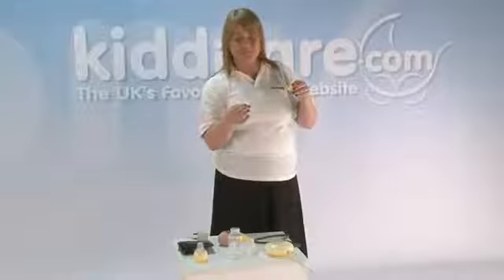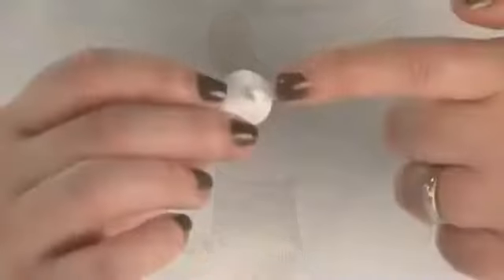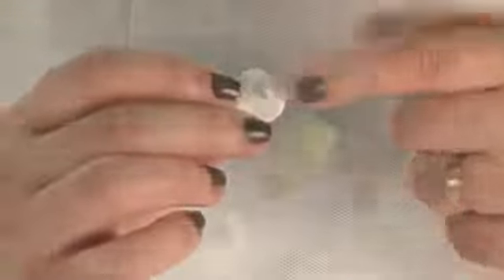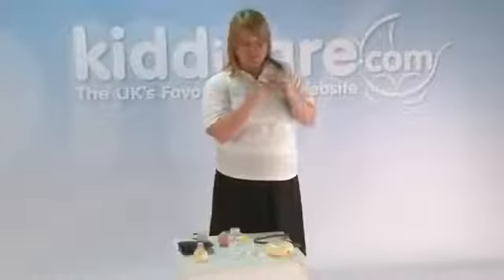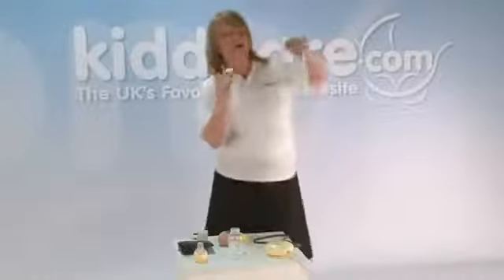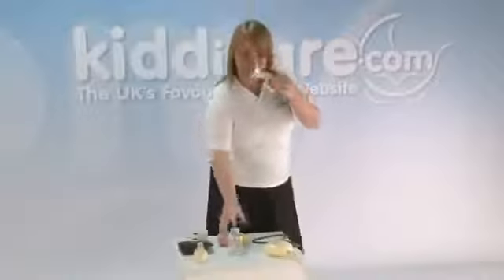that's absolutely fine. To put these items back together, what you find on the back of the white membrane is a little half moon, and you've got a half moon hole on that yellow valve. So you just push one into the other, and then you'll see it's connected and it won't pull out. And then you take the yellow valve, the main part of the pump, pop that on there and just push up with your thumb. The breast shield just pushes straight back in like that, and then you screw the bottle over the yellow valve.